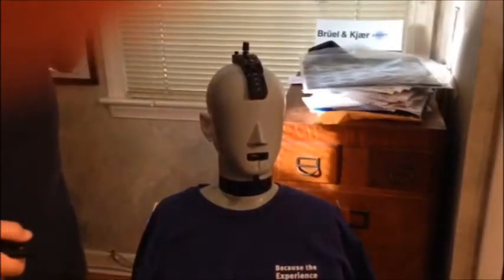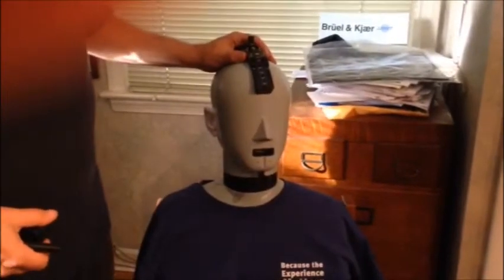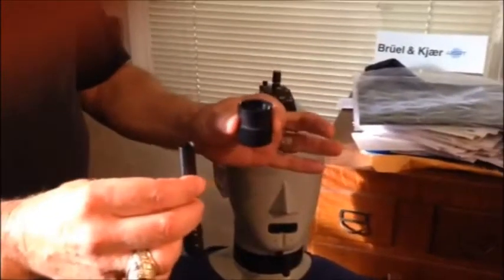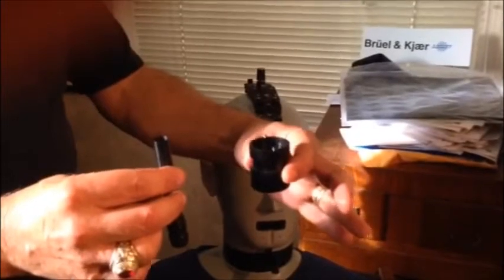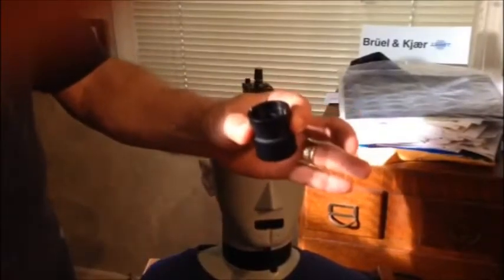We're going to do a short video on disassembling the coupler in the 4128 head and torso simulator. You're going to need these two tools that come in the kit — they'll be in the black case with the 4128. This tool is for removing the pre-amplifier and this one is for removing the coupler itself.